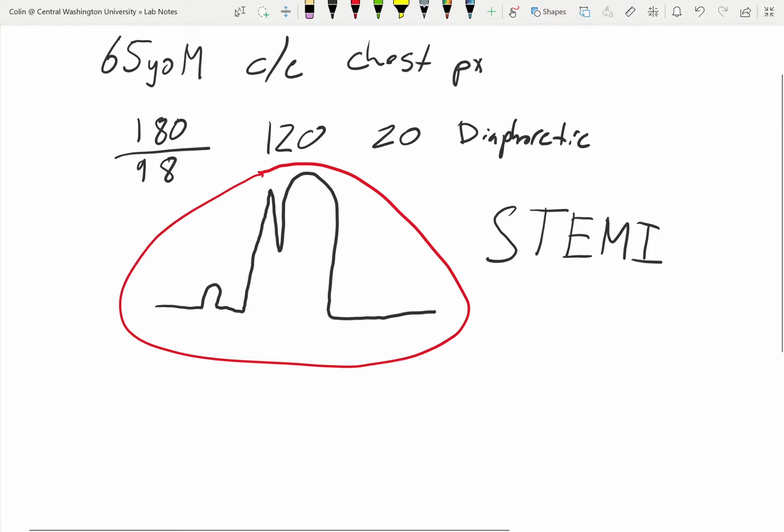Just like we talked about in class a lot of times, 90% of this job is just being a good EMT. And so what's different here that I talked about? Our medications? No. Our questions? No. The signs and symptoms? No. The only thing that's different is I look at the 12 lead and I can see ST elevation or not. And even if there is no ST elevation, what did I just say? Well, we're going to give them aspirin and nitro anyway. So, as an EMT, you can pretty much treat a heart attack the exact same way I would. Medics just have one more tool in the toolbox. And it's great to have, but it's not necessary.